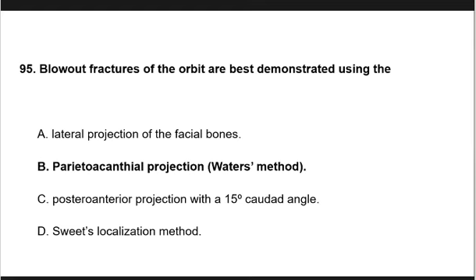Yan, balik tayo sa blowout fractures. No? Ang blowout fractures, that is the fracture which can be seen in the floor of the orbit. At ang nagde-demonstrate niyan ay modified Waters. Pag Waters method, ano ang other term? That is parieto-acanthial. Parieto-acanthial, or ano pang other term ng Waters method? Mahoney's method, sir. Mahoney's method, parieto-acanthial, or Waters method.